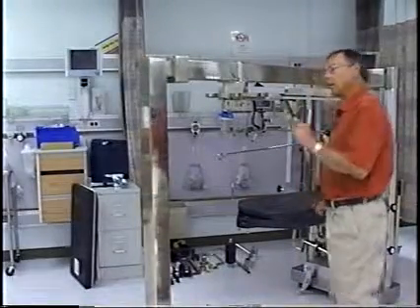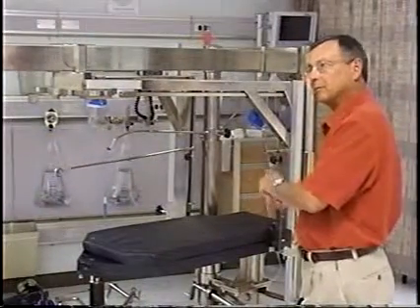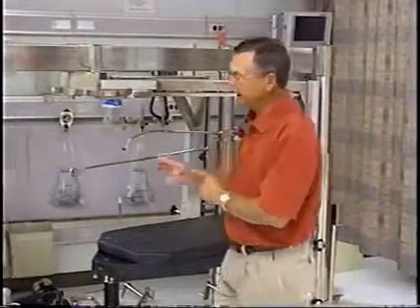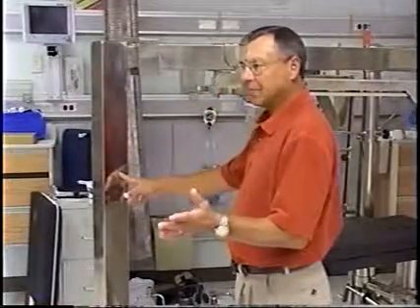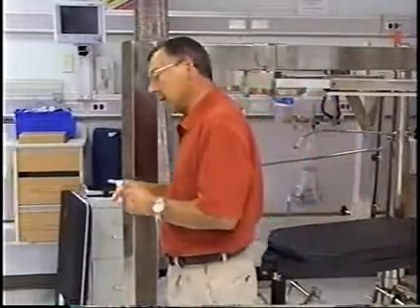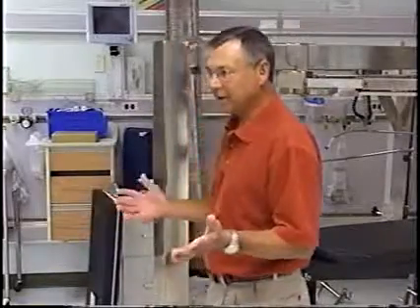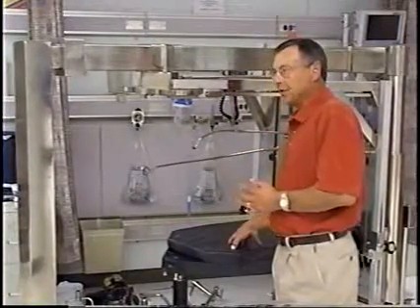Remember I said the first thing you do is to remember that anything you unlock, you lock. So let's assume that we've got a 78-year-old lady who stepped out of a cab at 10 o'clock at night, fell on the ice, and broke her hip. Now there are some questions even among orthopedic surgeons. Do old people fall and break their hip, or does their hip break and then they fall? I'm not sure anybody knows the answer to it, but your job is to make sure that when the surgeon gets in, you've got this table set up.